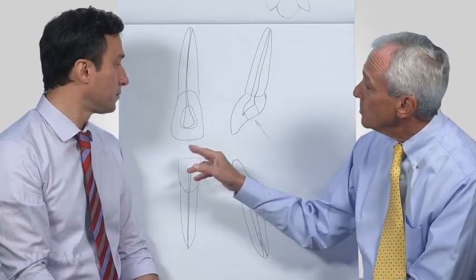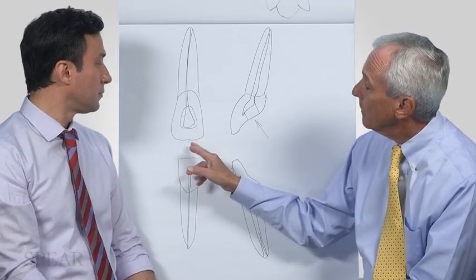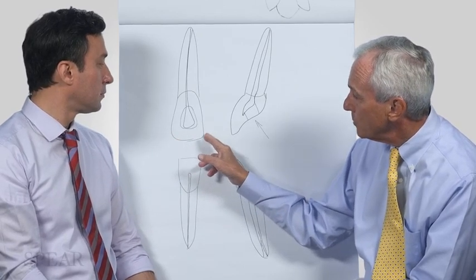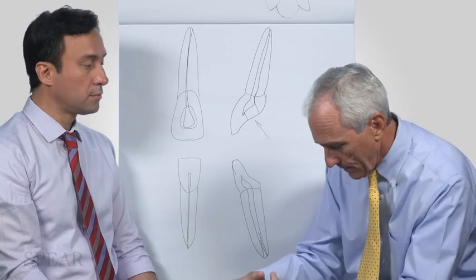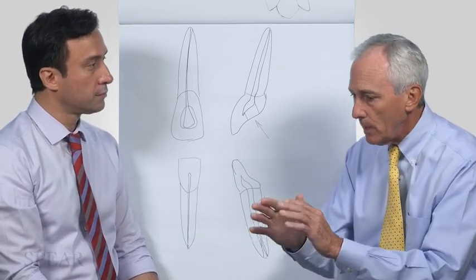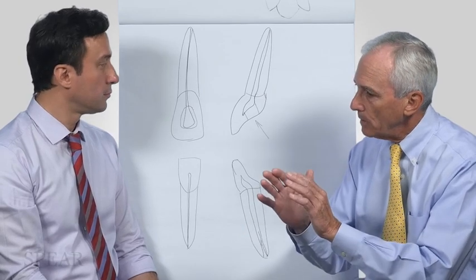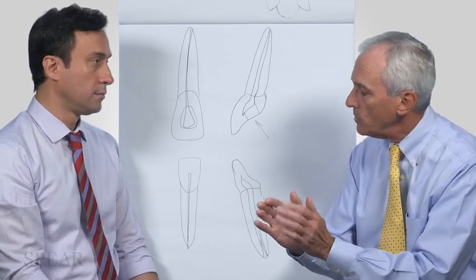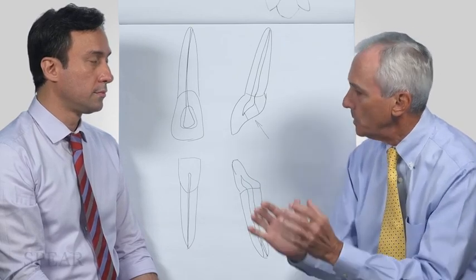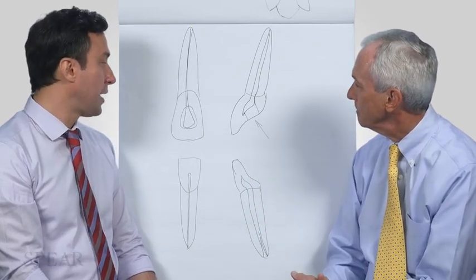Yes. As you mentioned, it is based on the developmental lobes, but in practicality, as you look at that surface, keep in mind that the ultimate end result of your access should mimic exactly that surface, but be smaller. Absolutely. So that is the key for incisors.